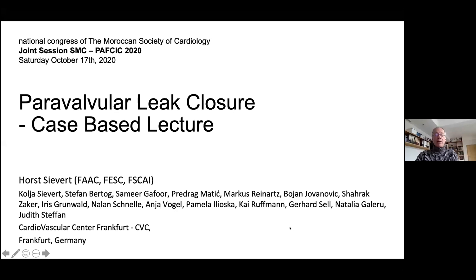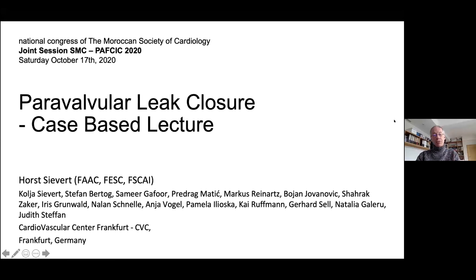Thank you very much for this introduction. An expert in everything means I have no idea of anything. This is about Paravalvular Leak Closure, and when I saw the title, I thought the best thing is to present a case which guides you through the steps of the procedure and also highlights the problems we are encountering with this procedure.